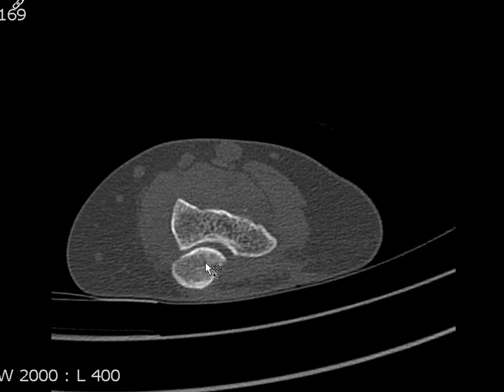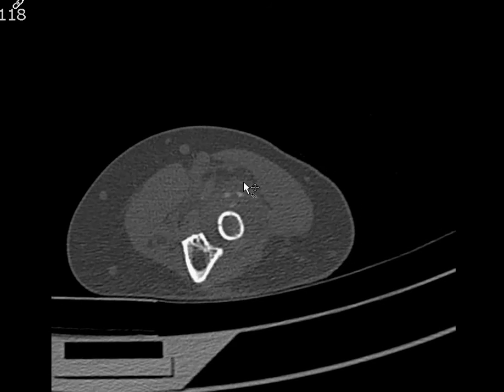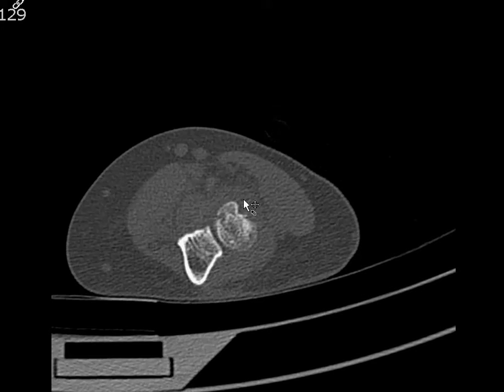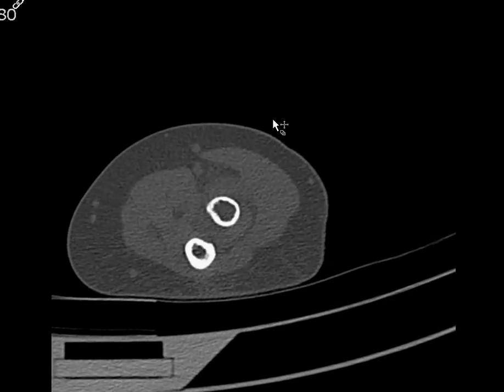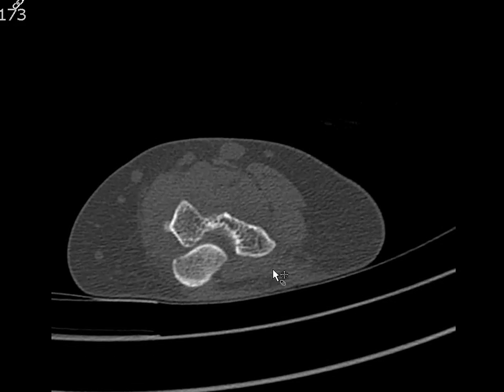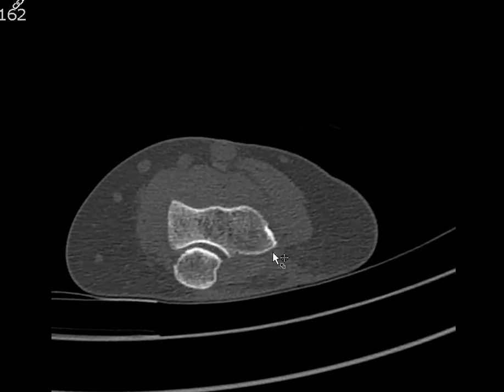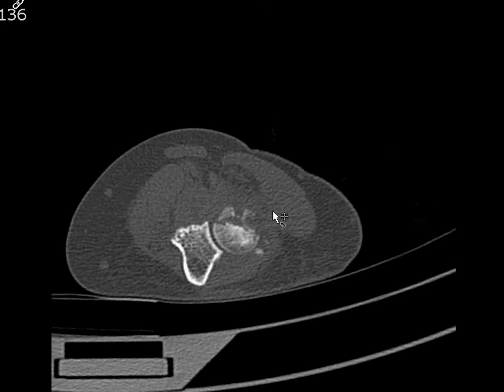I wanted to make a video about imaging planes for CT of the elbow. So here we have an elbow, axial images obtained in whatever position they are in, and there's a radial head fracture, by the way.